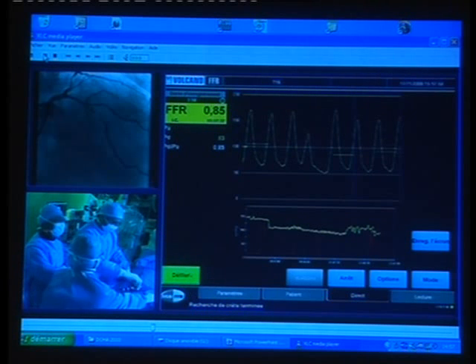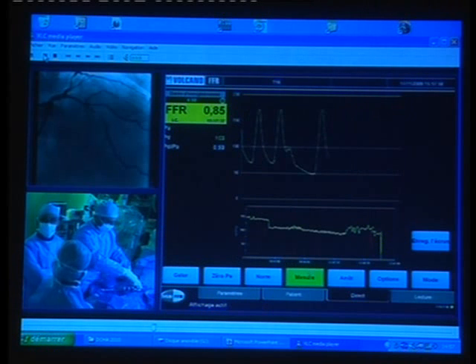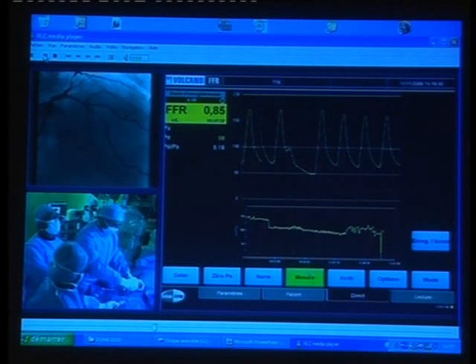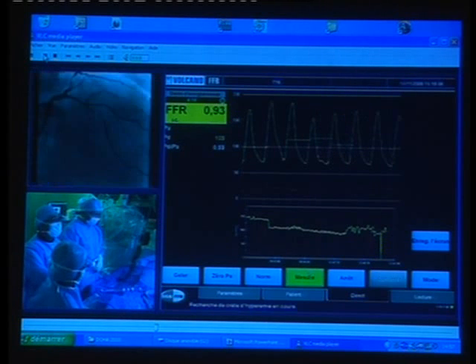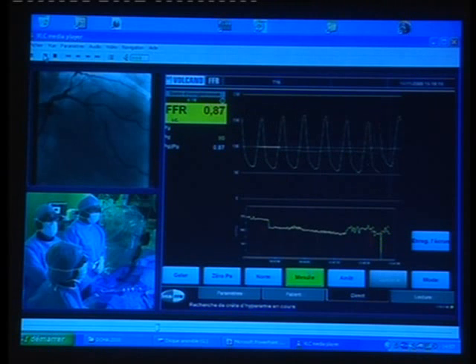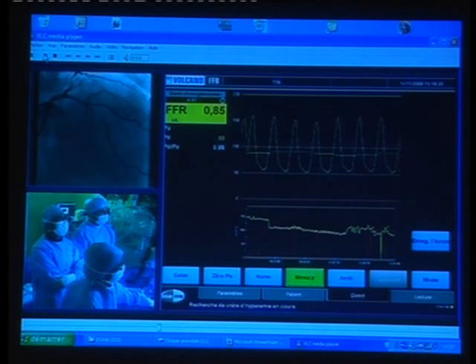In terms of the mode of delivery, it's perfect in this situation where you're really assessing a single focal lesion in a coronary. The proponents of the peripheral infusion, which I have to admit we use at my base camp, say that if you have an ostial lesion, it's quite difficult to assess because you have to disengage the guiding catheter.